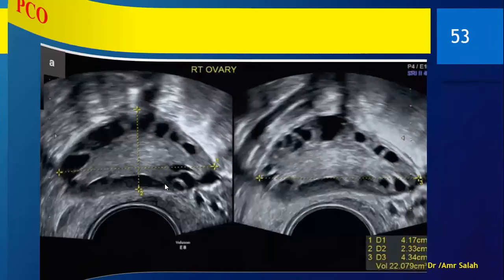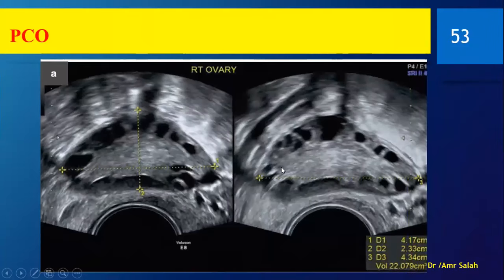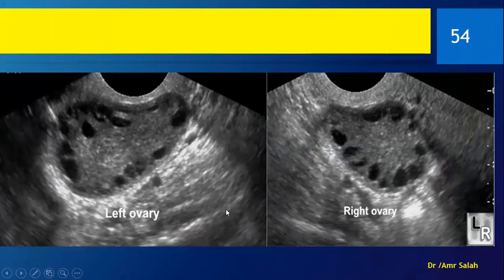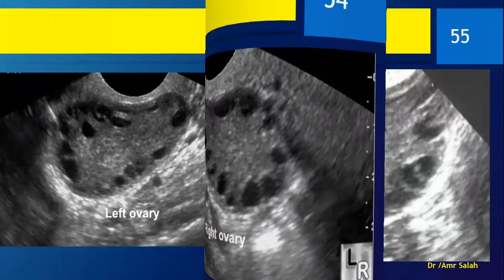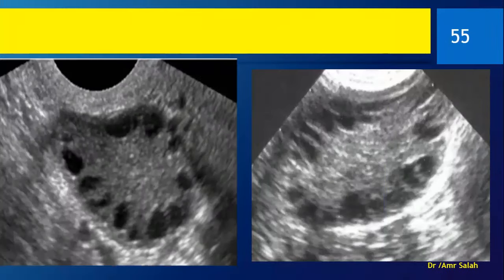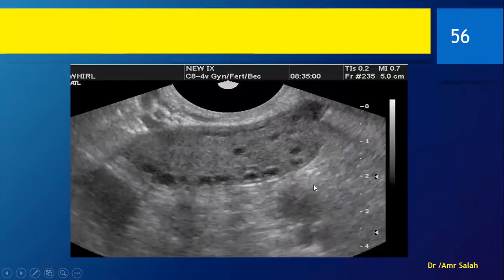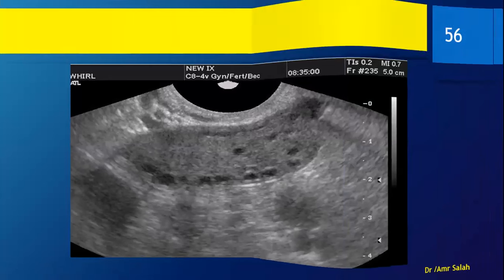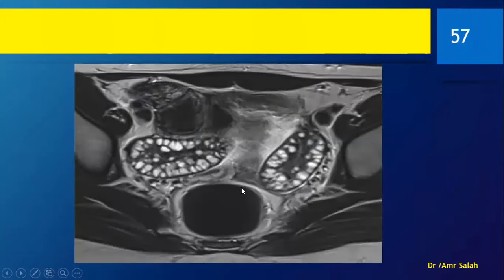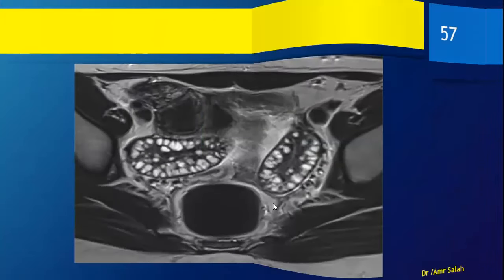Another example: follicles arranged in the periphery, small, multiple, central stroma echogenic, and the ovary itself is enlarged. Here also is how it looks on MRI.